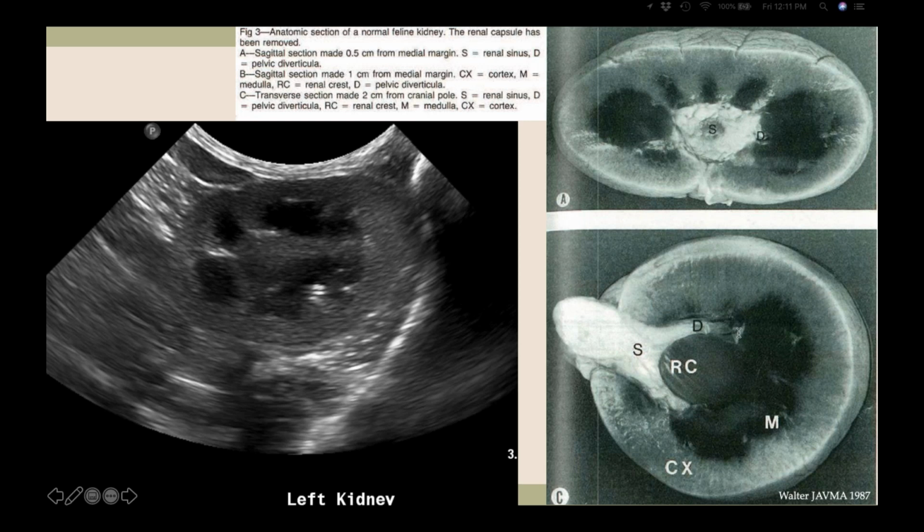So Ewan had brought up a question: is there a pathologic term for multiple diverticuli formed by hydronephrosis, or is it just a diverticulum? So one of the things that I look for, and I'll actually get to this in just a couple slides, is when these diverticuli become blunted and they become a bit retracted, to me is very suspicious for an obstructive process, and we'll show that in just a few slides.